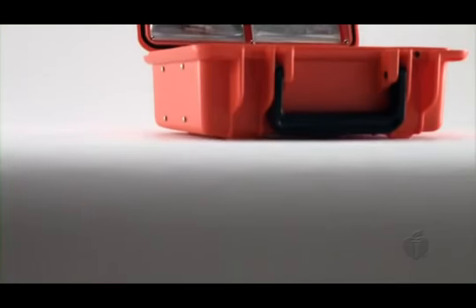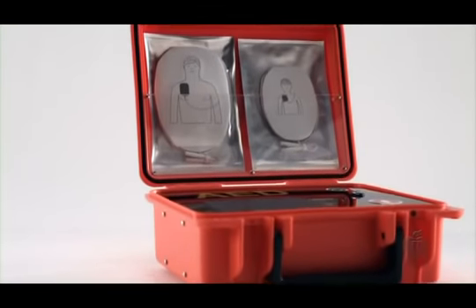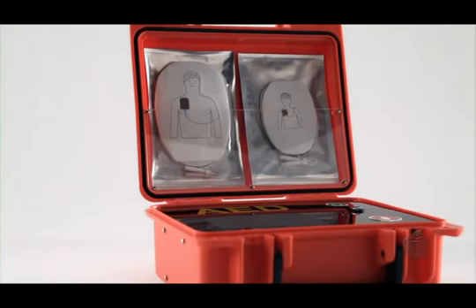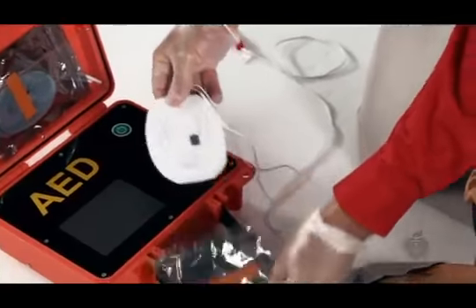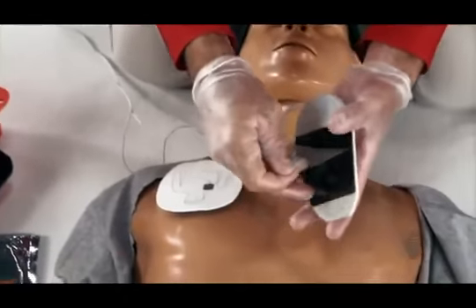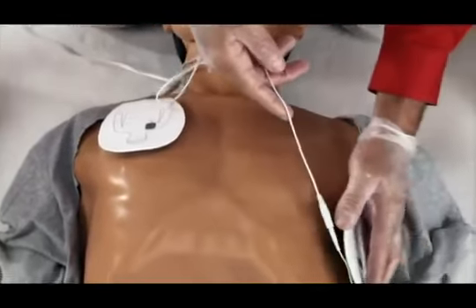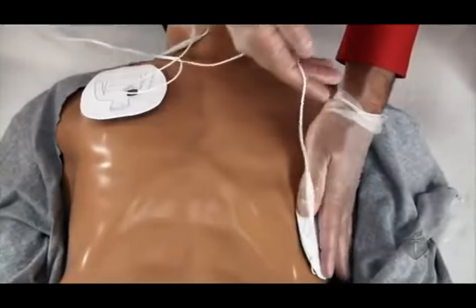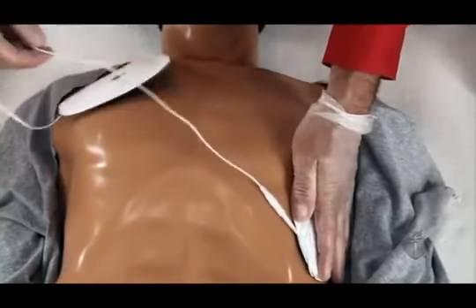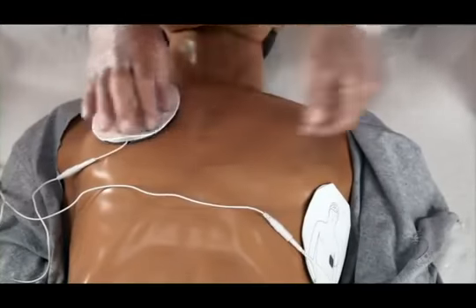Some AEDs may have adult and pediatric pads. Make sure you use the adult pads on anyone 8 years of age and older. Peel away the backing from the pads. Following the pictures found on the pads, attach the adhesive pads to the victim's bare chest. Place one pad to the side of the left nipple. Place the other pad on the victim's upper right chest directly below the collarbone.